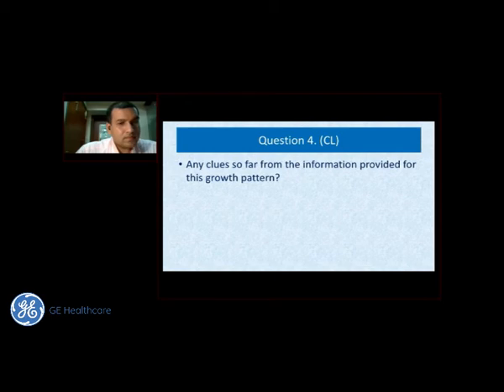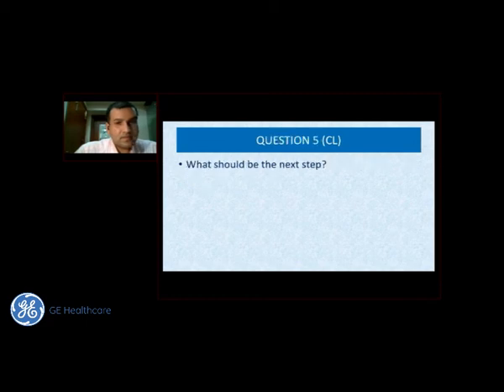So since you are hinting at a good anatomy scan, you probably picked up the line that there was maternal obesity and adiposity of the mother. Therefore, the transabdominal scan was not satisfactory. So transvaginal, I suppose. So would you like to do a transvaginal? So that is the next step. Correct. Which means that due to maternal adiposity, we should not hesitate in doing a transvaginal scan, especially if we are suspecting something. So any higher NT, any growth lag, we should look at the possibilities of transvaginal scanning.